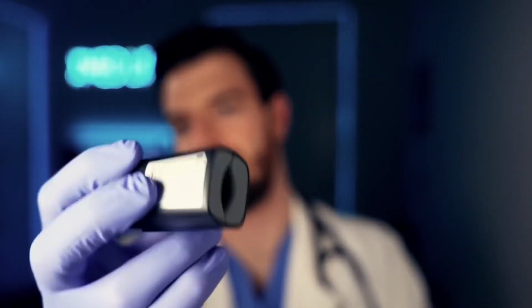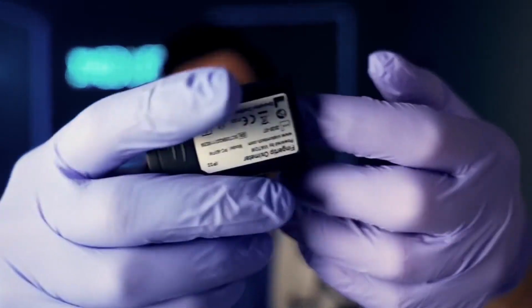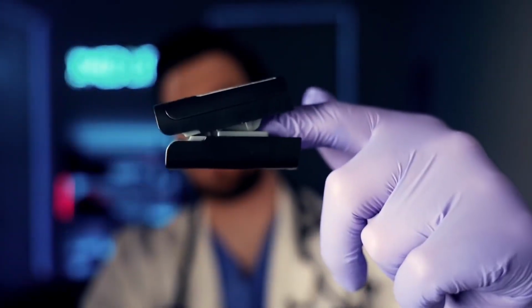Good. I'm still feeling here. I'm going to grab the pulse oximeter device. Here we are. Great. Still counting that pulse. We'll get ready with your oxygen saturation here. Good. You can relax. We're going to place your finger in just like this. Okay? So nothing to be concerned about here. Your finger will go just like that.